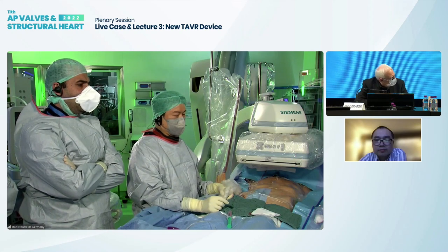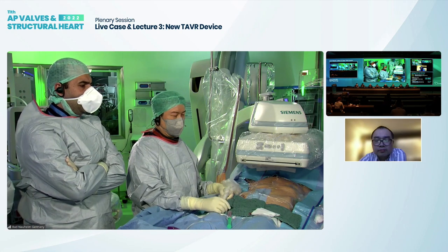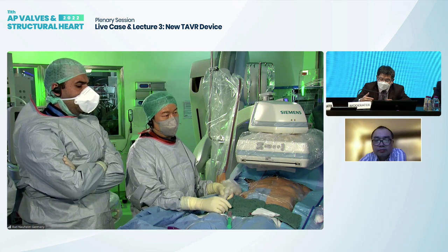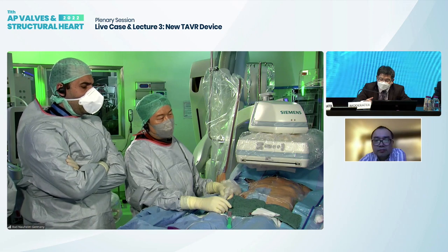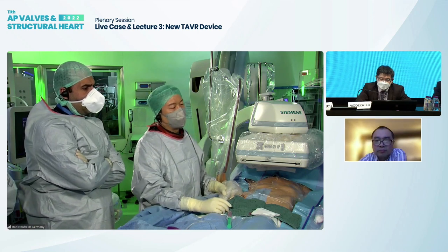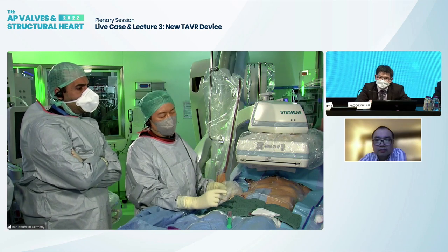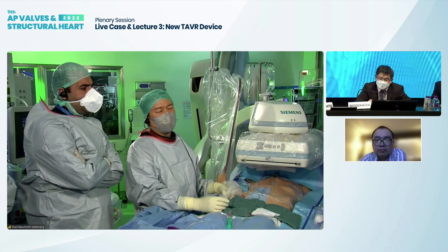I see. Any other comments? Yes, go ahead. I'm Warit, from Thailand. In a patient post bypass, is the height of the vein graft, or its distance from the annulus, any concern for the Accurate Neo valve? No, not at all, because for the stabilization arches there's not much material, and also the total length is below 5 centimeters. So I would not expect any interaction with the bypass grafts.